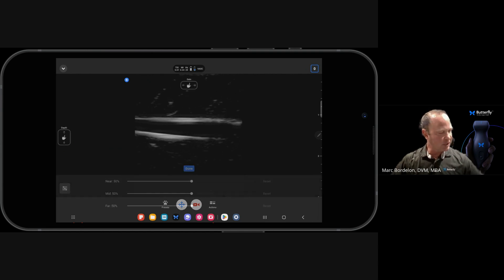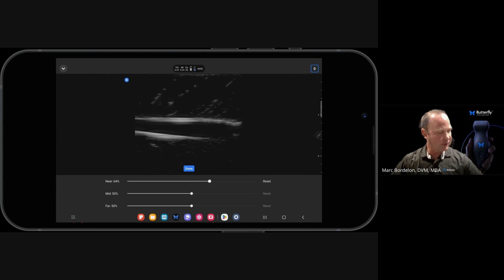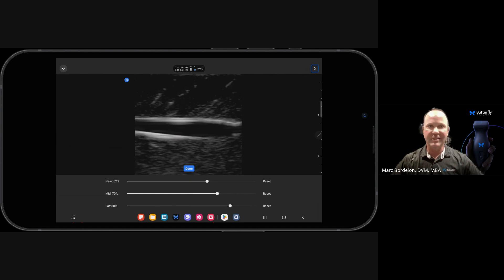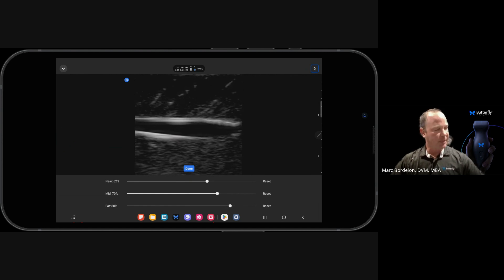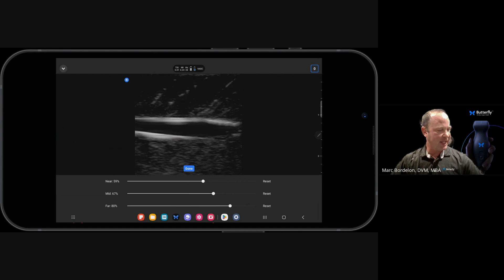Next thing I'm going to do is adjust my time gain compensation controls to just some settings that I prefer. And again, this is very user dependent, but those are settings that I prefer to scan at.